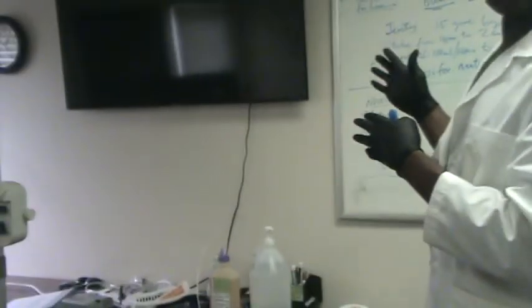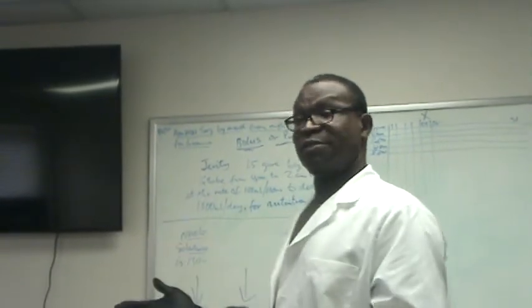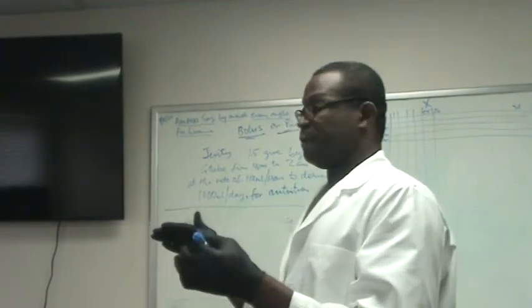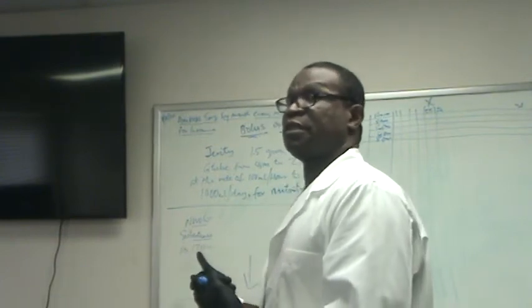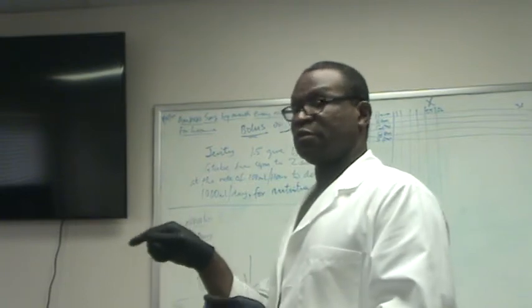run for about 10 hours. For some people it's 8 hours, some people it's 12 hours. It depends on the person's weight or what the doctor ordered, the rate per hour. So you need to know how much she is getting per hour and how much she is getting per day. That has to be programmed into the machine.